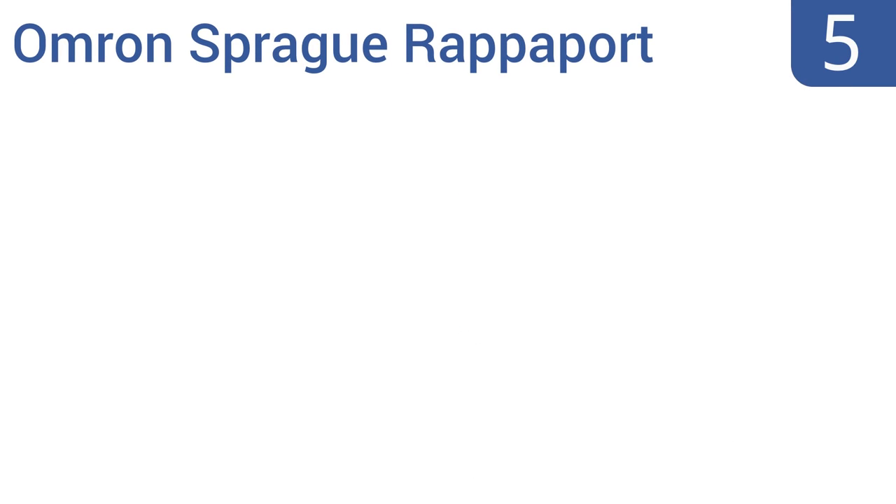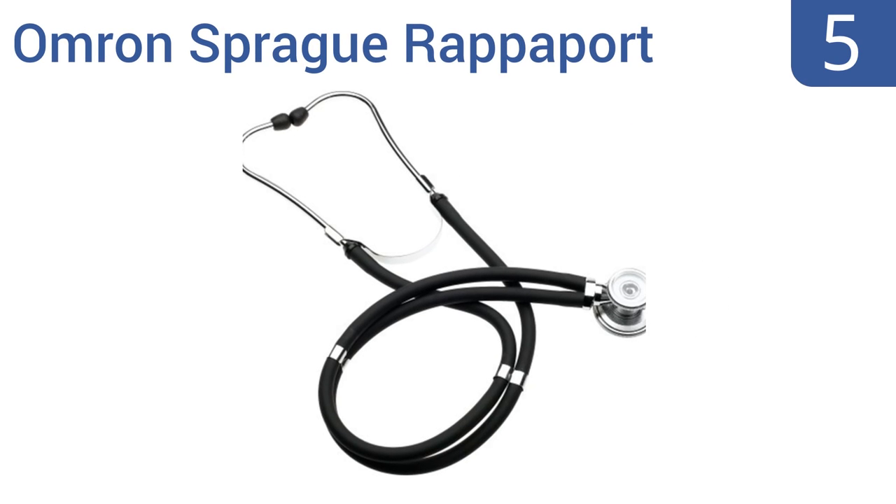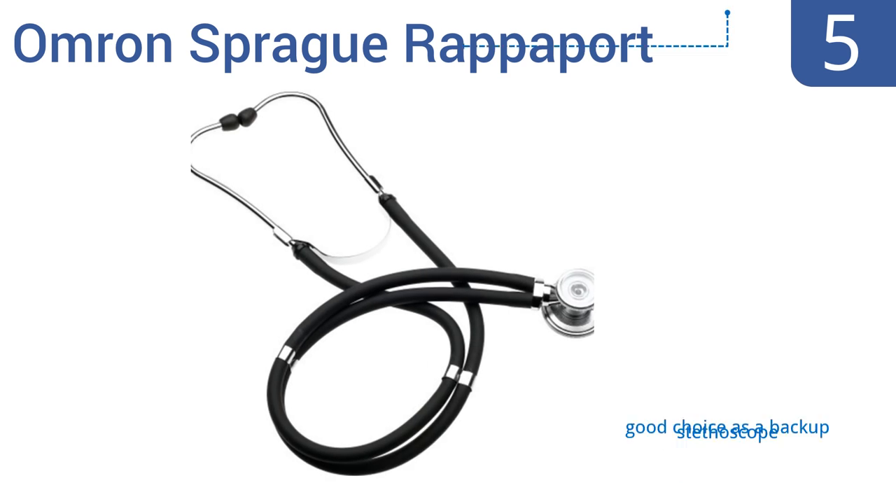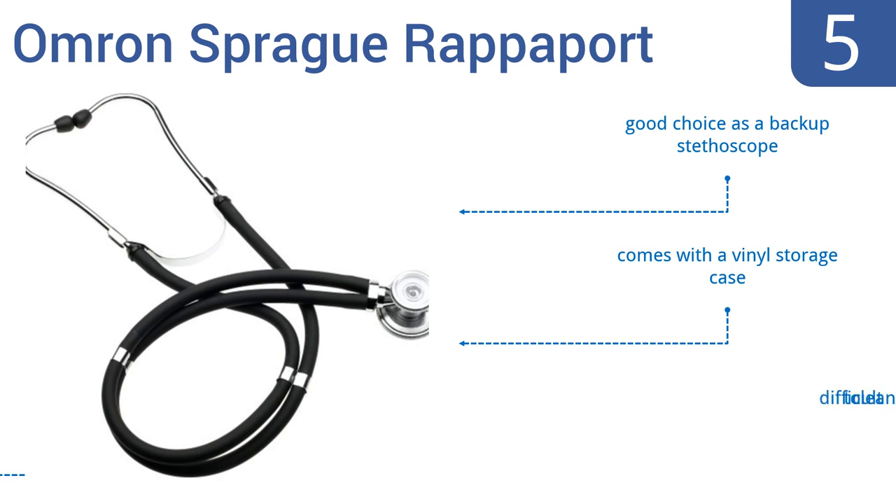At number 5, the versatile Omron Sprague Rappaport is available at an extremely affordable price and includes three different sizes of open bells, two sizes of diaphragms and interchangeable ear tips, making it a great value. It's also completely latex-free with a chrome-plated chest piece. It's a good choice as a backup stethoscope and comes with a vinyl storage case, but it is difficult to clean.